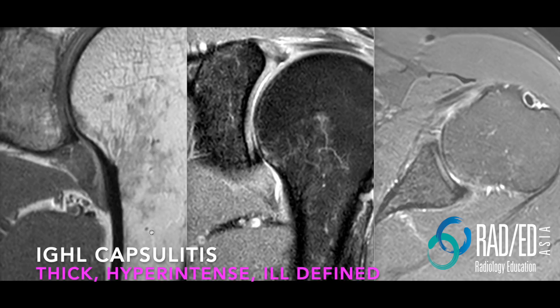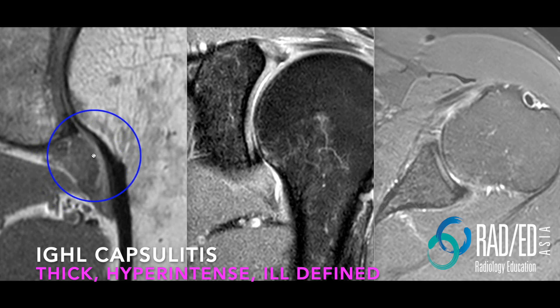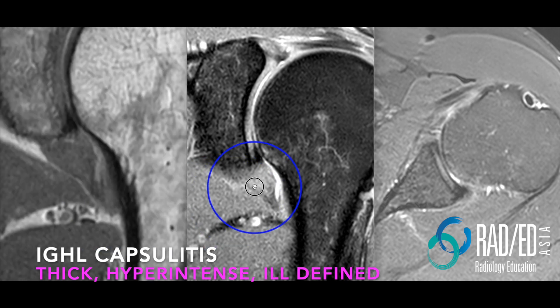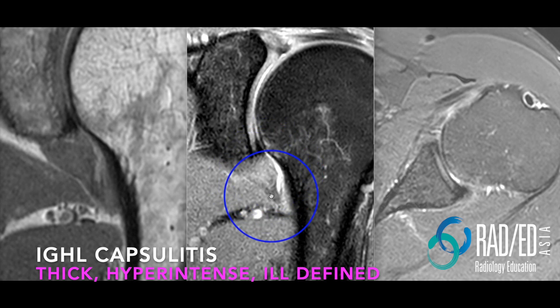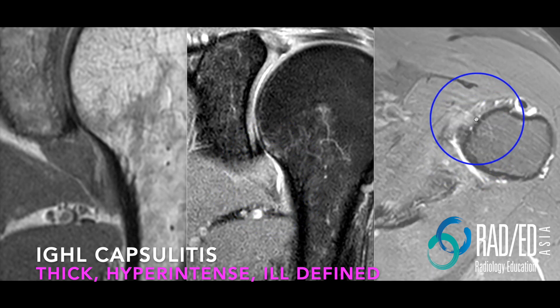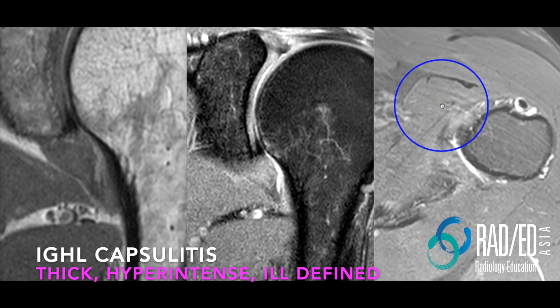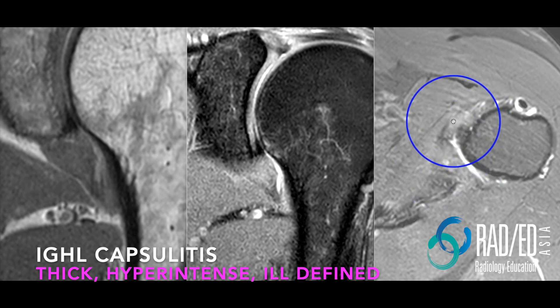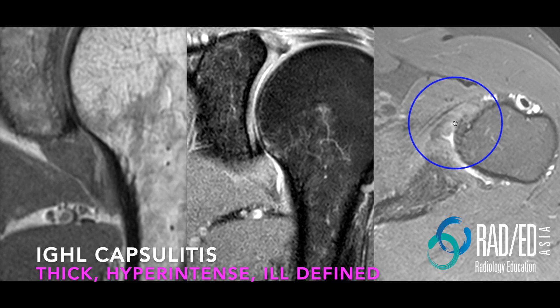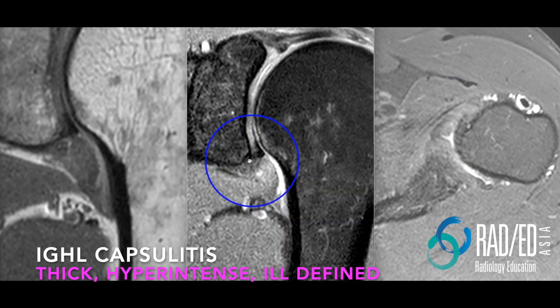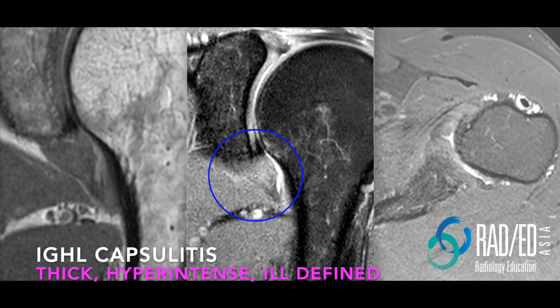What does it look like when you get capsulitis? The IGHL becomes thickened and hyperintense — it has lost the black signal. On the PD fat sat it's hyperintense and thickened. The signal intensity gets close to muscle, which is why there isn't much contrast between the two. For IGHL capsulitis, look for thickening, hyperintensity, and ill-definition of the IGHL.